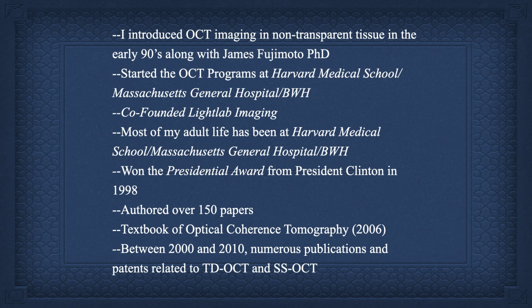But I want to point out a lot of groups in the early 2000s published papers on SS-OCT, improving the optoelectronics and making this better. And I actually wonder if we hadn't pushed so hard for non-transparent tissue, particularly cardiology, where we needed this speed, whether SS-OCT would have even arisen very much at all, whether time domain OCT would have been the standard if ophthalmology was the only clinical embodiment. And I'll try to explain that a little bit in a minute.